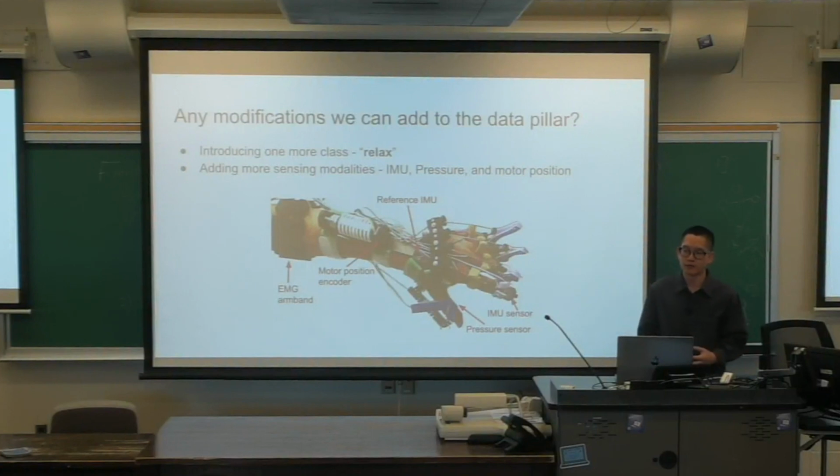It helps relieve their spasticity and the tension in their muscles. Cool. So that's the first thing we did. And the second thing we did is we are adding a lot more sensing modalities.